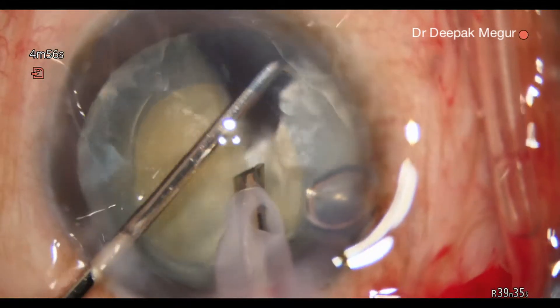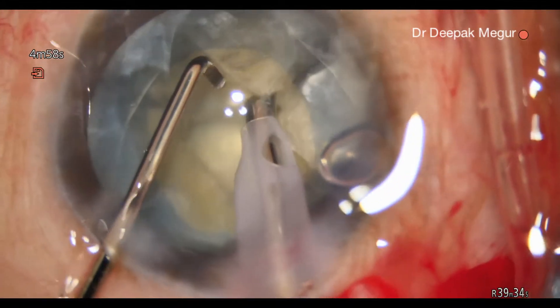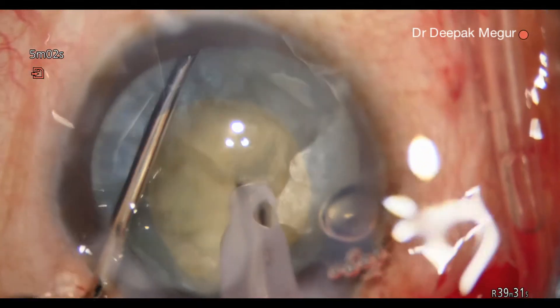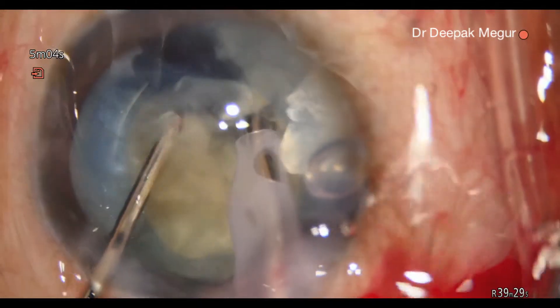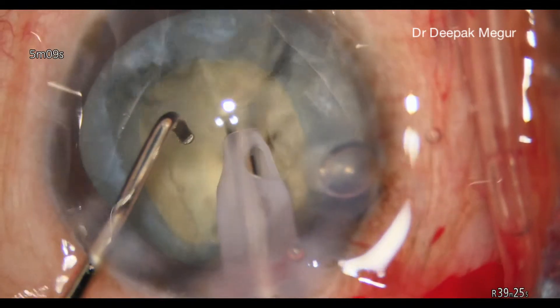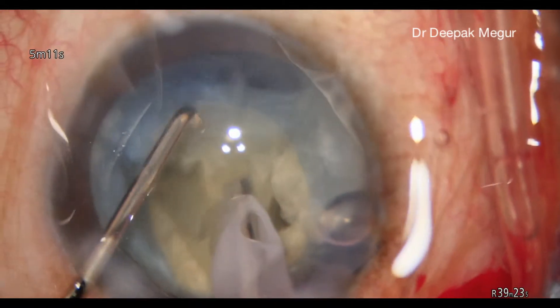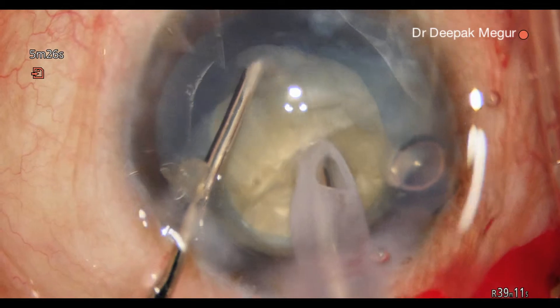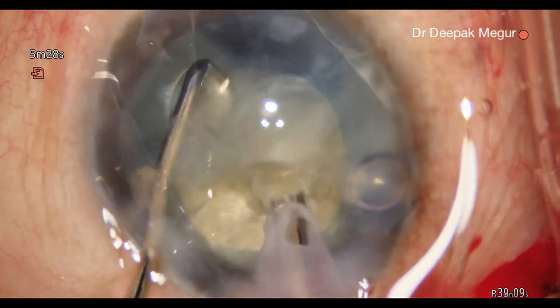Then we proceed to do phacoemulsification of the nucleus. It's critical to remember that in these eyes we are having a smaller rhexis. A smaller rhexis is much more vulnerable to getting damaged during the chopping maneuvers, so it's important that we keep this in mind.